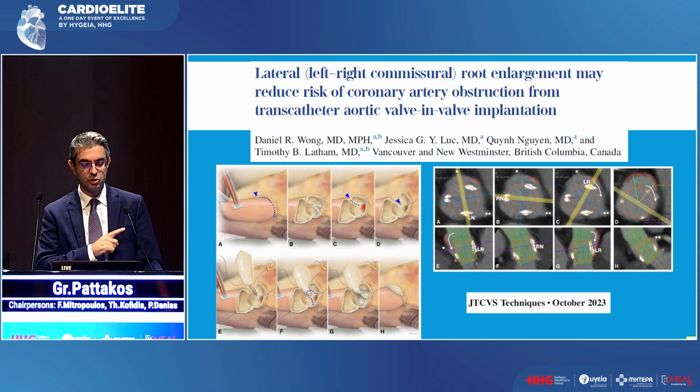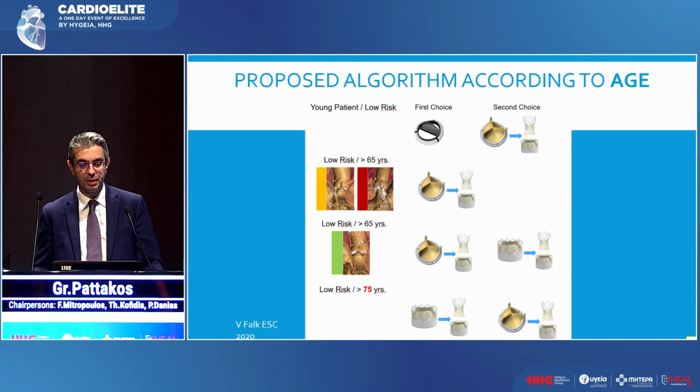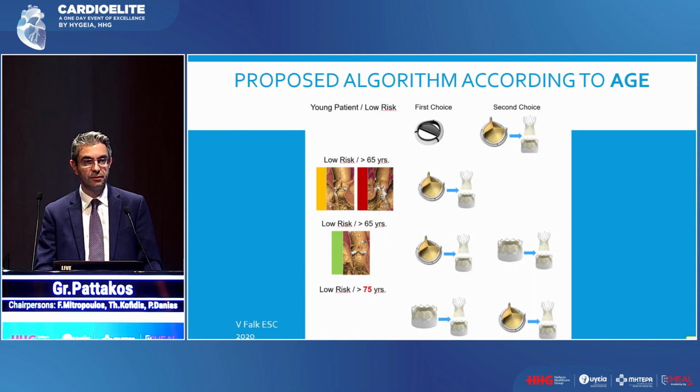Not to mention that a number of these procedures have been shown to decrease the risk of coronary obstruction in the future when you're going to need to do a valve-in-valve procedure. Our good friend here and pioneer in transcatheter valves, Vinny Bapat, has come up with technology of biological valves where the ring can also expand. So aortic root enlargement plus these valves are really the future for patients who want a biological strategy.